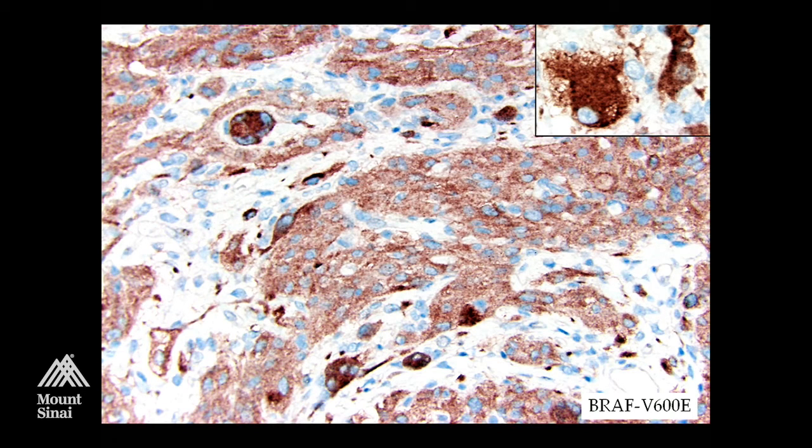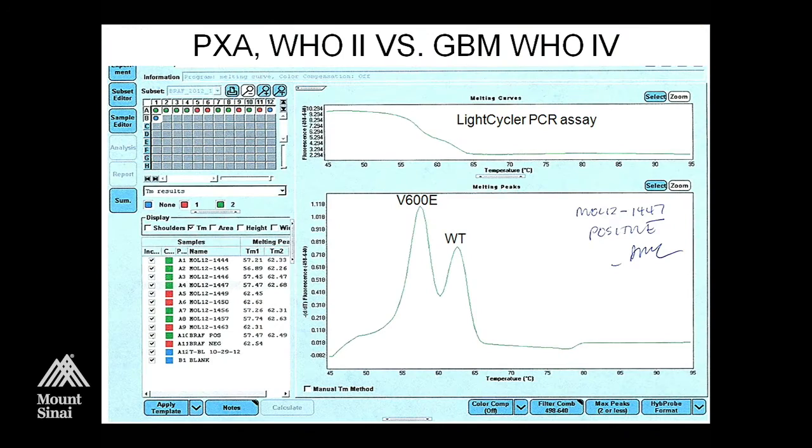With, like the other markers I mentioned, there is now an antibody for BRAF V600E. When it works well, it's great. Sometimes it's equivocal. It can be weakly positive, and you're not sure if it's background. And in those cases, we reflex to sequencing.